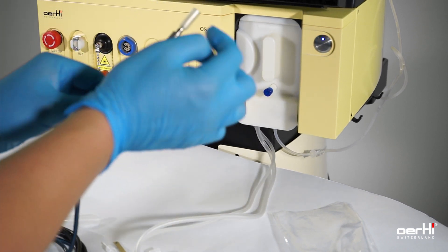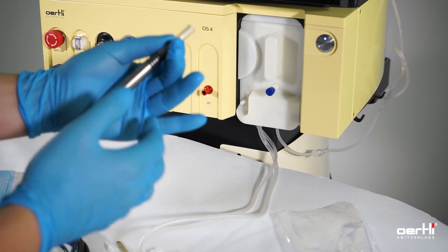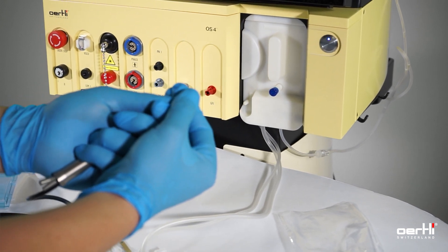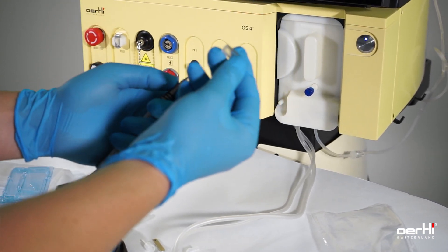For removing the cap, use the left hand pointer thumb in between, like this. And with the other hand, you can now remove it controlled to avoid any bendings, damages, or uncontrolled quick movements.